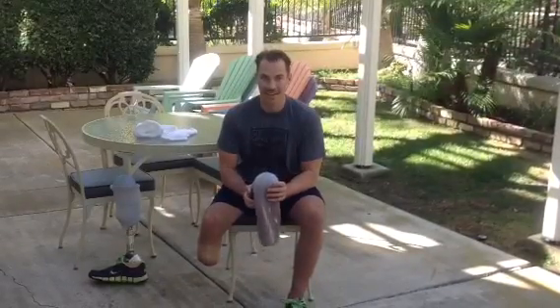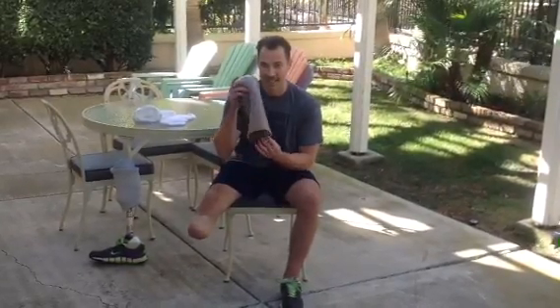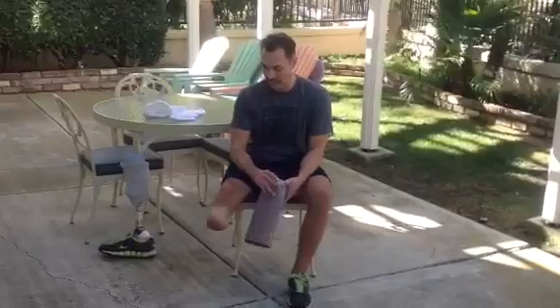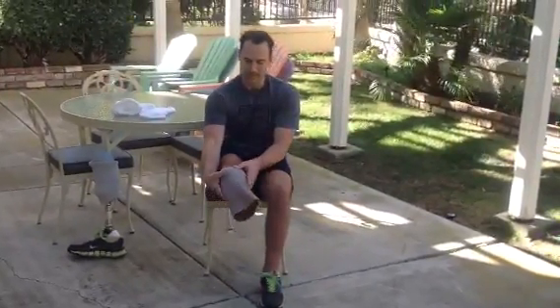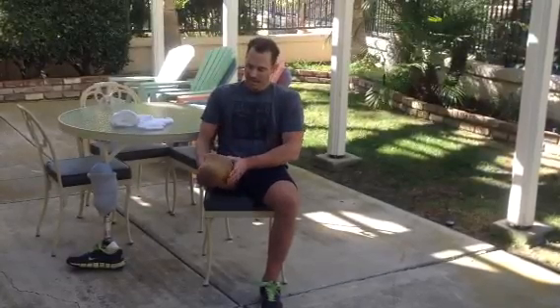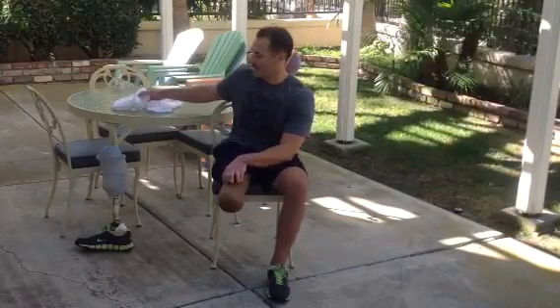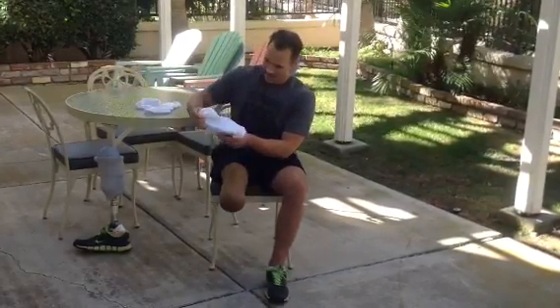Here's the update for those who are interested in how this works. I'm going to put this on — take the first few steps. So this is the liner, this goes over my leg. Since this is continuing to shrink, I use socks to fill in the space until I get my permanent prosthesis, which won't be for another couple months.